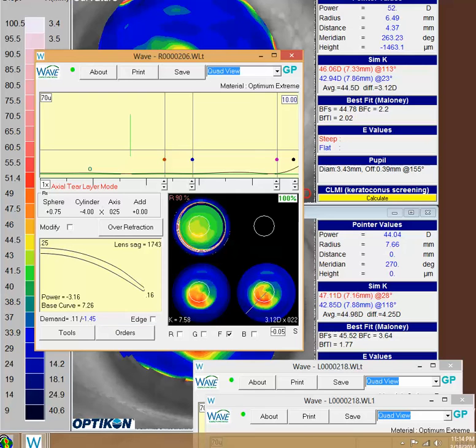So now what you have is the powers that were in the old contact lens, but with a free-form design on the back surface of that lens to try to match that cornea. And sometimes that'll take out this erroneous data that we get from these toric powers. What's probably happened with some of the fluctuating vision, you might have more of a front toric lens created by the free-form, trying to incorporate this. And when you get that, if you blink, it's going to rotate around and give you some weird power effects. So I would almost say go for the free-form back surface, but use the tool to add the power in. And that I think will help get you where you need to be on that lens.